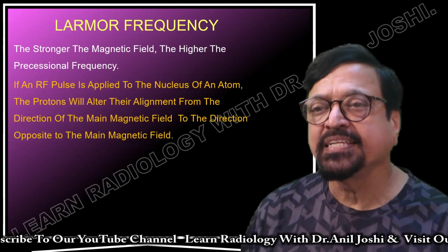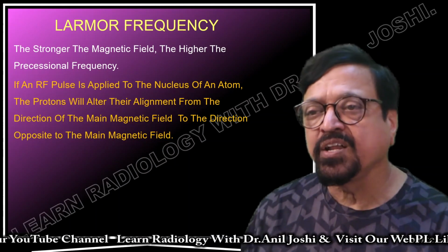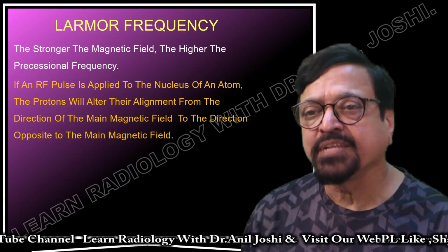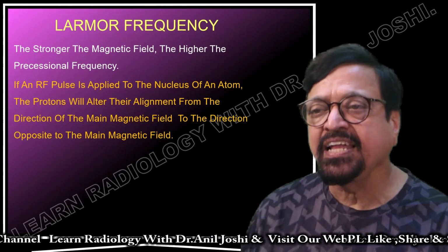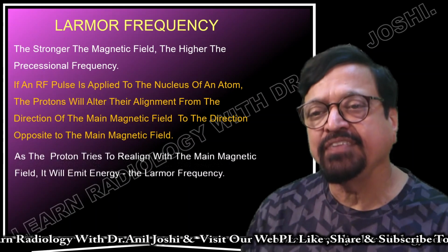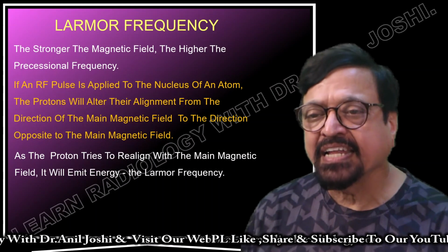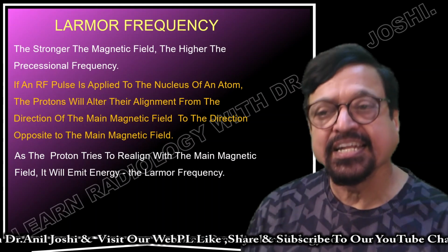If an RF pulse is applied to the nucleus of an atom, the protons will alter their alignment from the direction of the main magnetic field to the direction opposite to the main magnetic field. As a proton tries to regain alignment with the main magnetic field, it will emit energy.